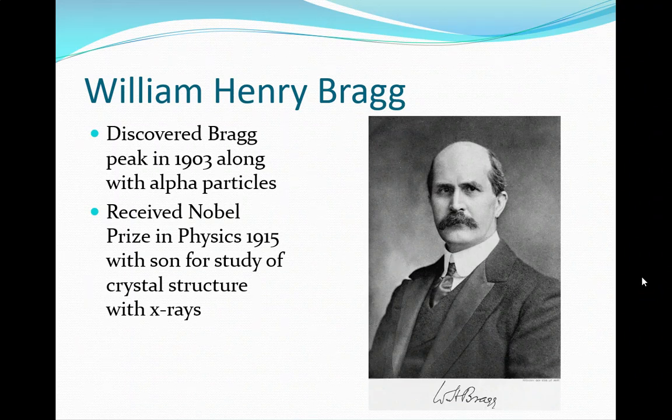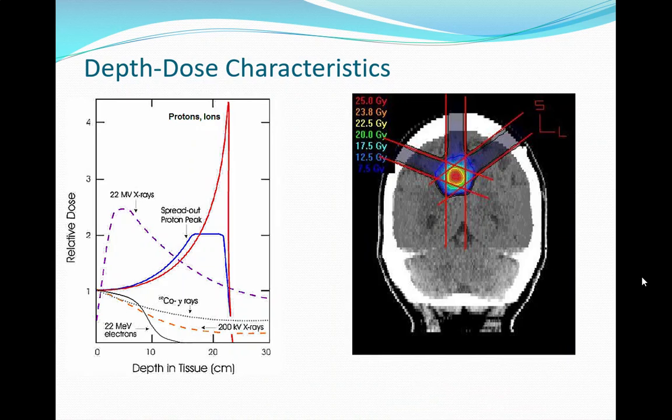It's kind of cool, too, that it was interesting enough that his son actually got involved. So that's kind of a cool project, father-son thing. Okay, why the heck do we care? Right? So here you can see the Bragg peak. Now what I'm showing you here, these are called depth versus dose curves on the left here.